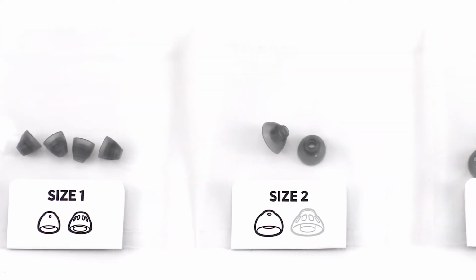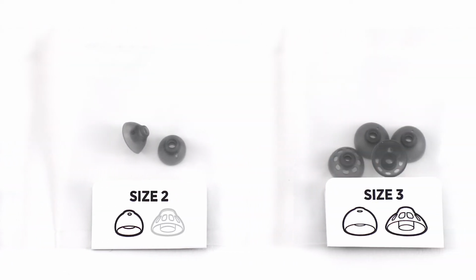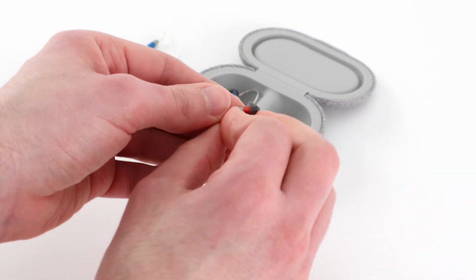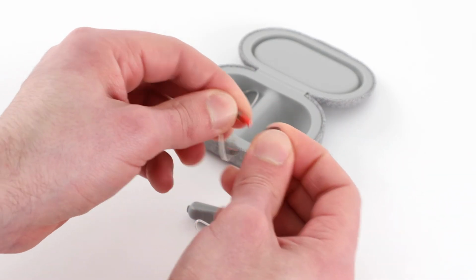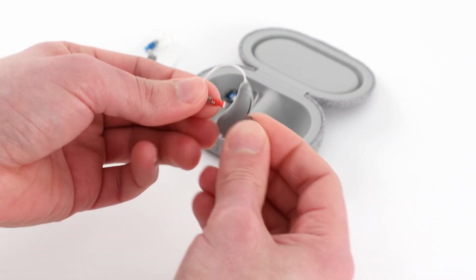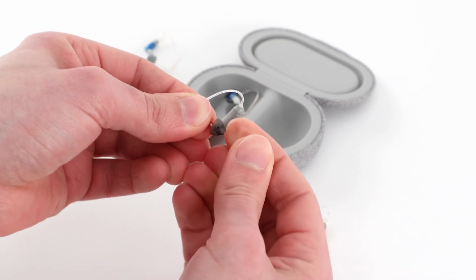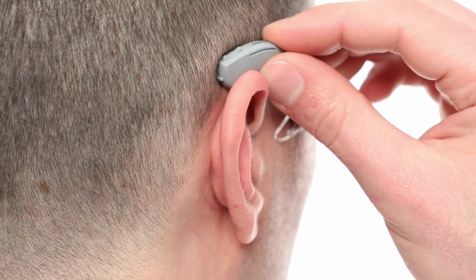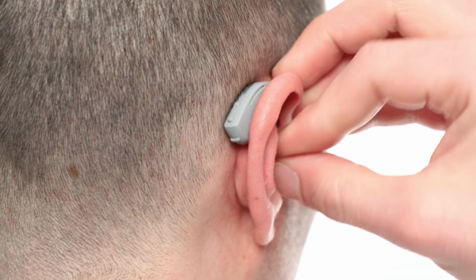Next, if you have new ear tips, select the size you want to use. You can also pull off the ear tip from the old cable and reuse it. Make sure the ear tip is secure before putting the hearing aids back on. Otherwise, the ear tip could become stuck in your ear canal.